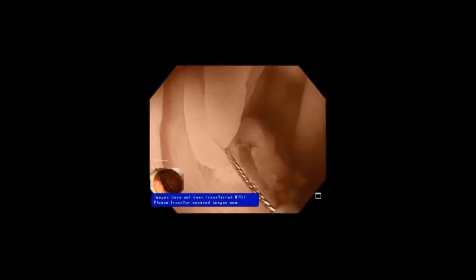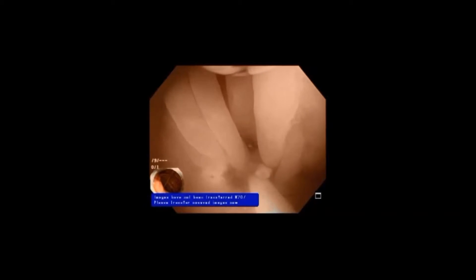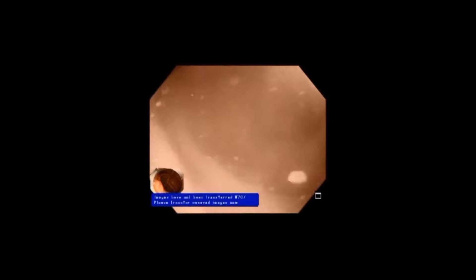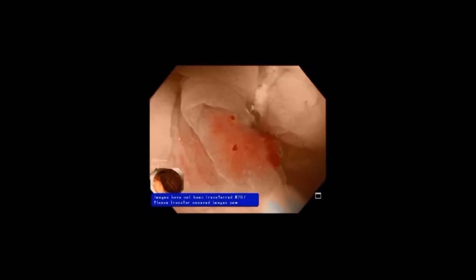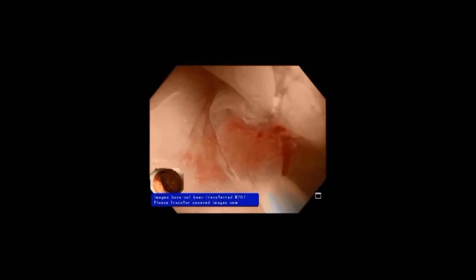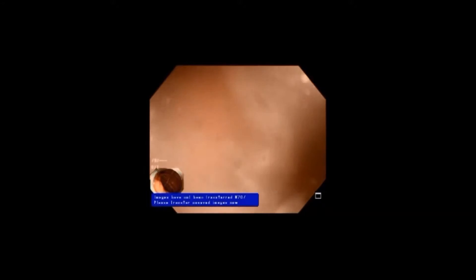Ken Benmohler has advocated marking the lesions with APC. Once you get underwater, you can delineate the edges of the lesion by APC marking. APC will work fine underwater, just like the snare works fine underwater. I found that generally I can see the lesion quite well. That little red area there we're resecting with some surrounding mucosa. So we're ending up with a piecemeal EMR, but we're still getting an effective EMR without performing injection.